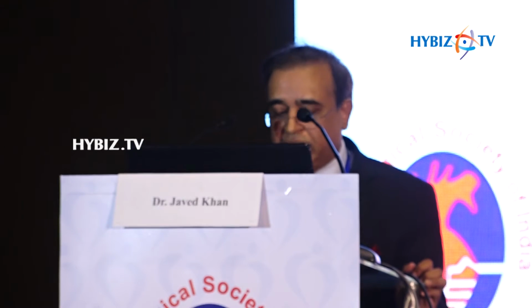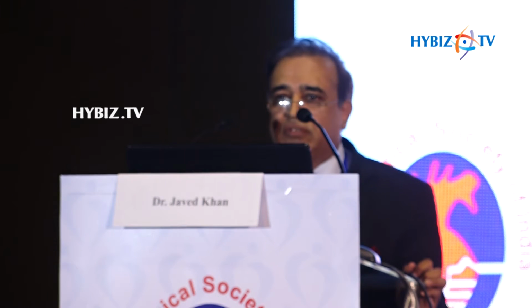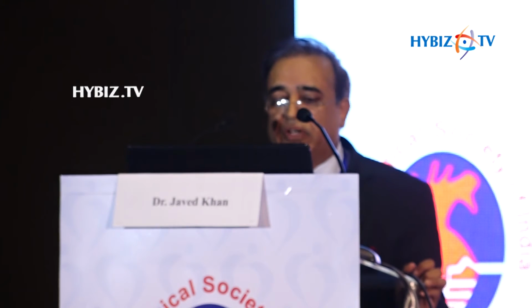We can see in the mid LAD there is a tight lesion, and immediately after that there is a diagonal coming out. As usual, the guide wire was passed through the lesion and ballooning was done. Everything was under control. The patient was asymptomatic, vitals were maintained. You can watch, the contractility is also fine.